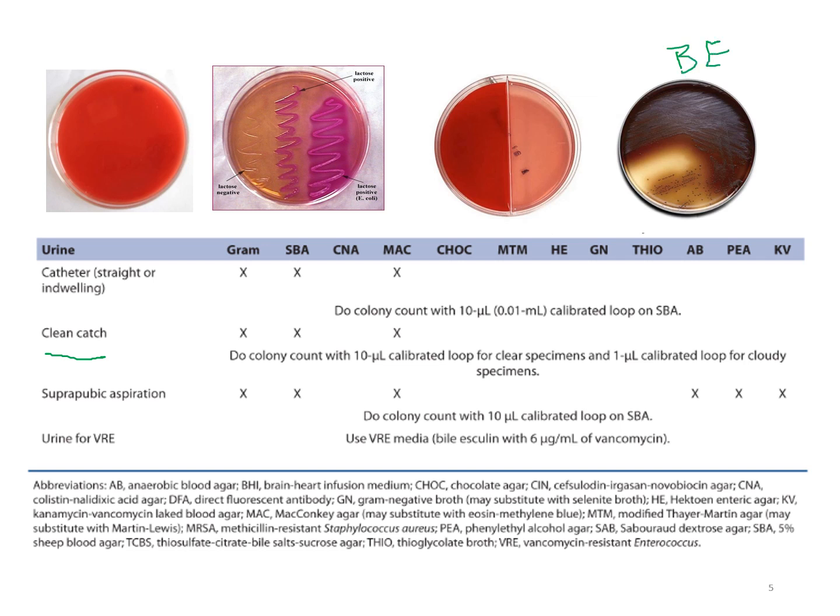Some labs might use some of the other gram-negative media to help with identifying some things. It just depends on your particular site, but most places are going to stick to just a sheep blood agar and a MacConkey, maybe possibly bile esculin, depending on how many urines you get a day and whether or not it's more cost effective to do that bile esculin first and time efficient to get that early identification.